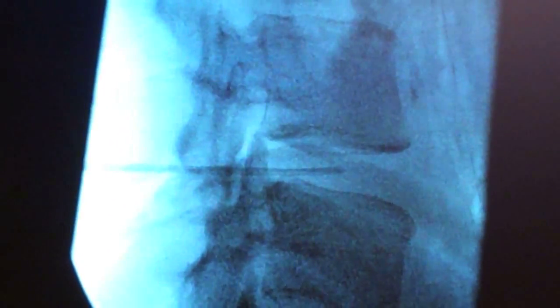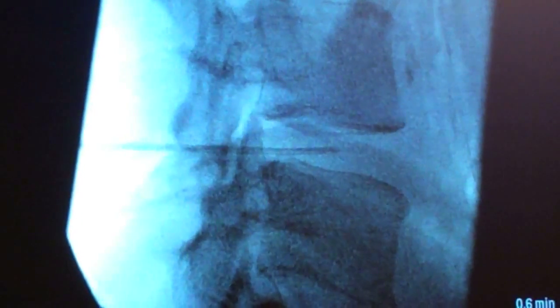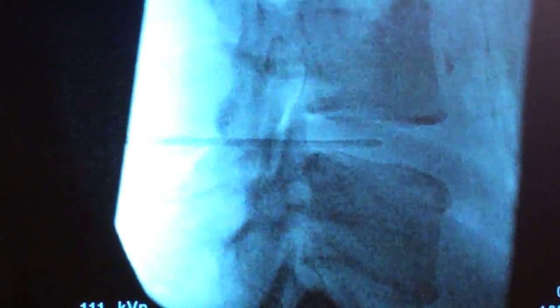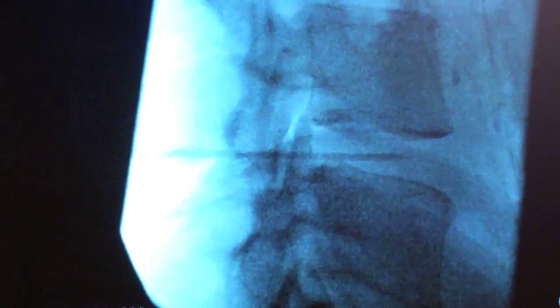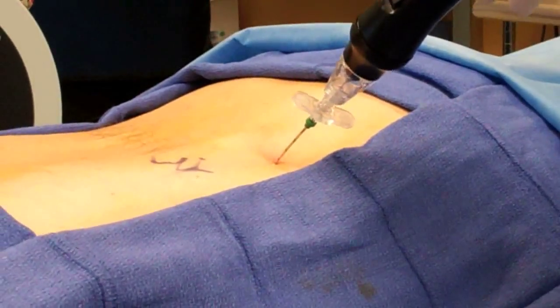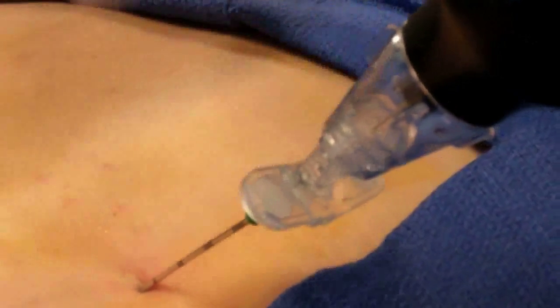I'm going to make several passes in and out for 60 seconds, and we do that three different times. It's just going to suck some of that central disc material out. We're going to get started here — go live. And then we're just starting to move in and out. You're going to feel some pressure here. You're doing very good. Okay, you can see some of the disc material just coming back into the chamber there.